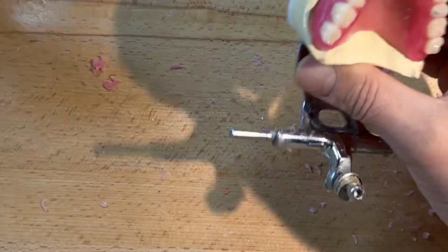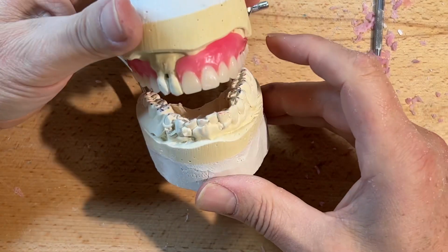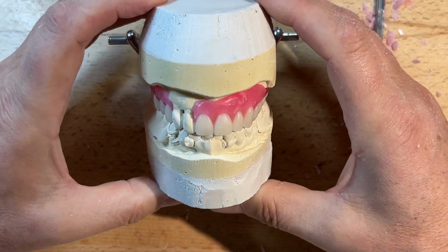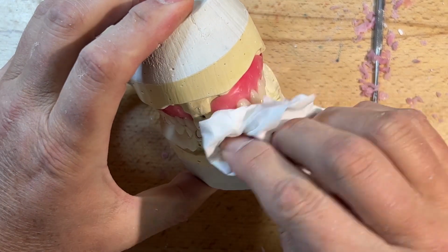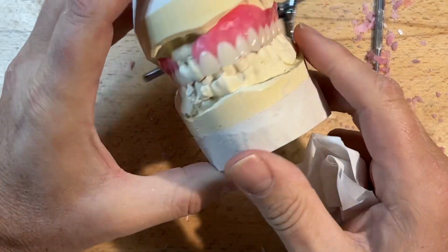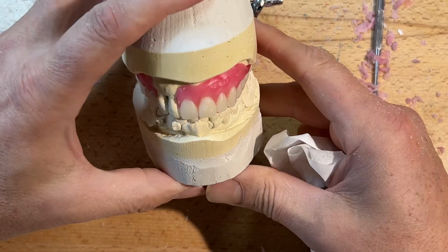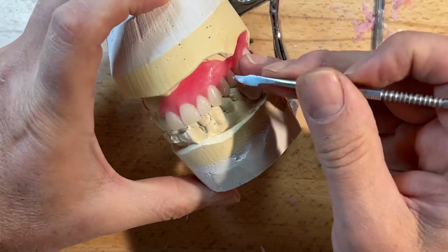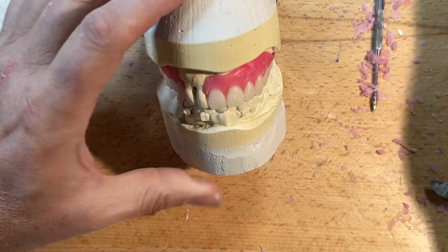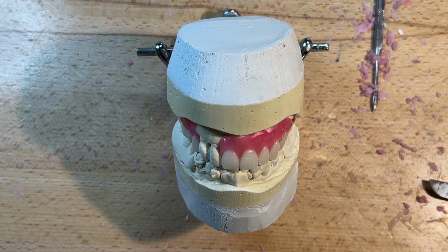Oops. You can see there's no editing here. Now, there we have an immediate denture transitional. It's going to be for try-in, and we're going to double check at the try-in the excursions to make sure there are no eccentric contacts. Some aesthetic consultation with the client, and some consultation on expectations of the client during surgery and after surgery of these two teeth, and expectations of now a full denture prosthetic versus the partial denture prosthetic they had. And I think it's going to be straightforward. So I hope you enjoyed that. Until next time.